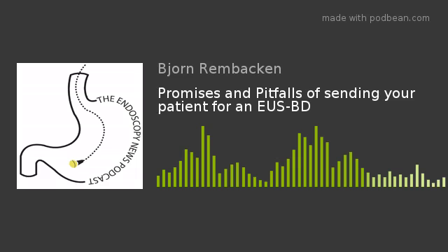If pneumoperitoneum had been noted during the procedure and the patient gets a bit of abdominal pain, if you scan the patient quite quickly after the procedure, you will still see it, but it may not need reintervention, and after some time that air just reabsorbs. So it's taking things in the context of the patient.